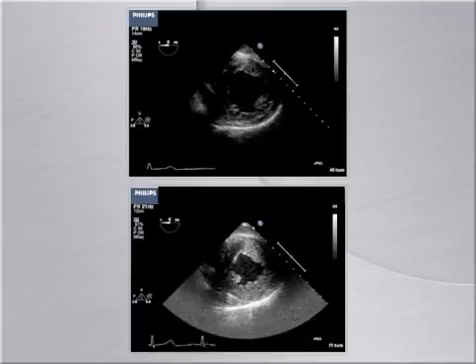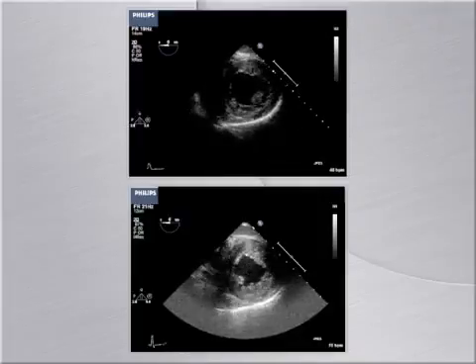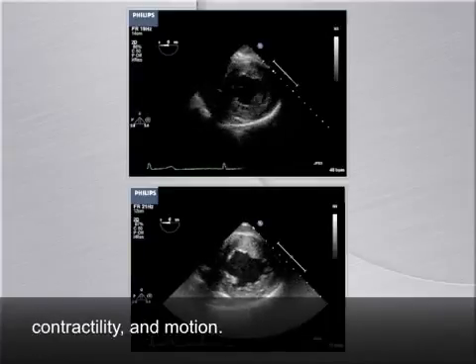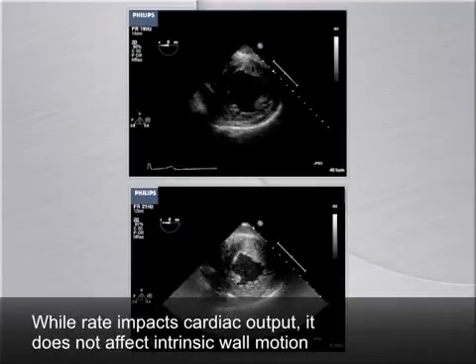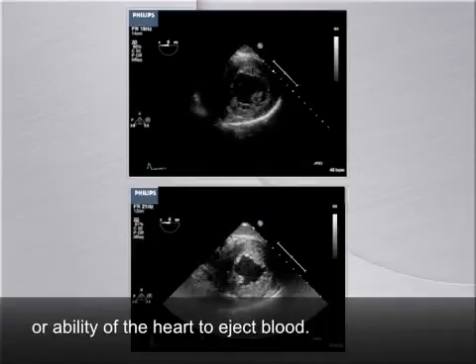The slower heart rate in the top image may lead to a false sense that it is less contractile. It is important to exclude rate from assessment of thickening, contractility, and motion. While rate impacts cardiac output, it does not affect intrinsic wall motion or ability of the heart to eject blood.